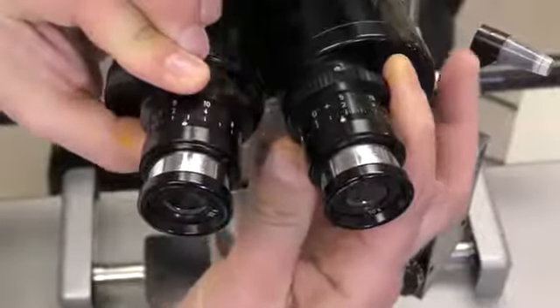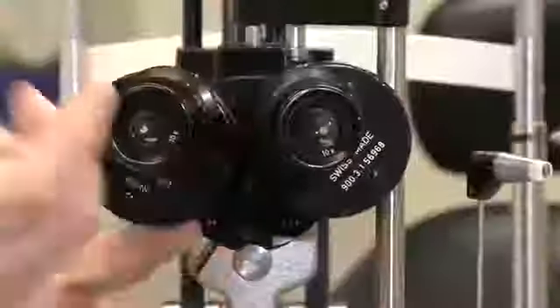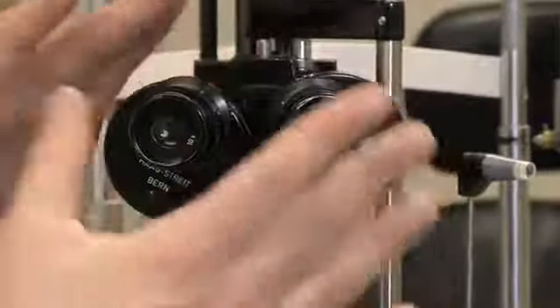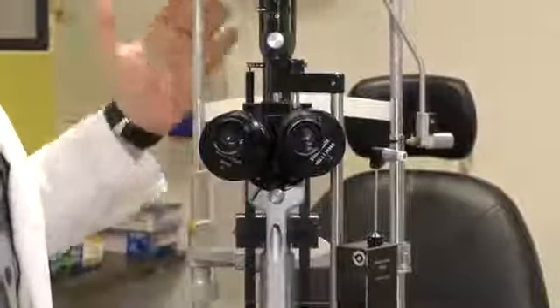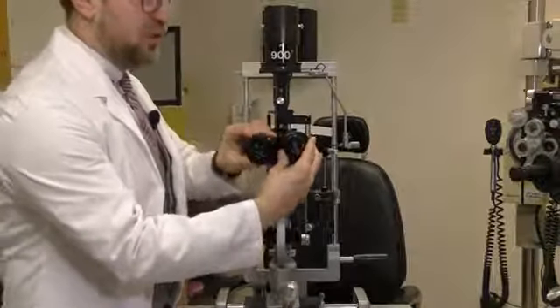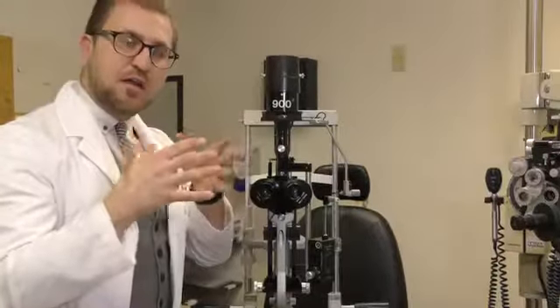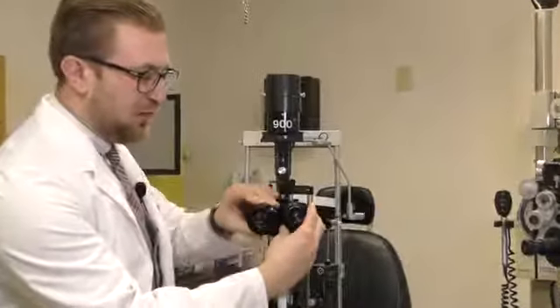On the binoculars here, you can see it goes to plus and minus. So you can turn the dial and move it from plus to minus depending on your prescription in either eye. Also, you want to adjust your pupillary distance, which is very important. What I do is I typically look through here and focus on a structure. For example, if the patient's sitting, I can take a look at their cornea. And I pull the binoculars apart or push them together depending on your pupillary distance until the view becomes binocular and you have good stereopsis and the image becomes very clear. So it's more of a feel, just pulling it apart and pushing it together.